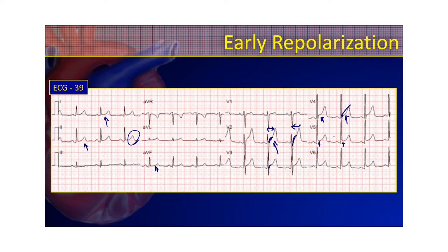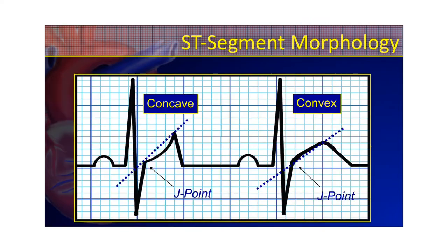Here we have an STE mimic of early repol. Again, I told you about ST-segment morphology. I can't stress this enough: concave is usually not bad, but it could be bad. Convex — just consider it always bad. That's going to be an MI every time.